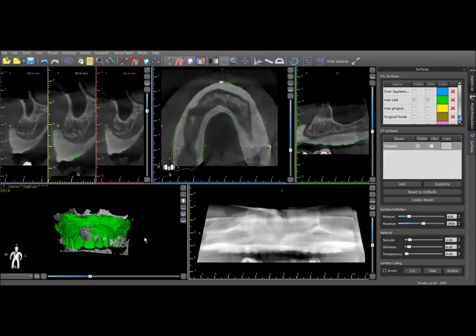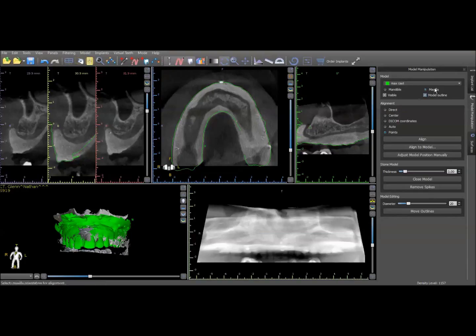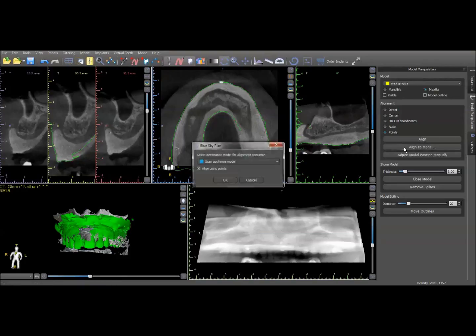Now that we've got our first STL imported, we need to find a way to get the tissue surface imported. You would import your second STL — I already have that done — but now we need to align it. We're not going to choose 'align' on this one; we're going to say 'align to model,' because that's going to allow us to align to the model we just imported previously.